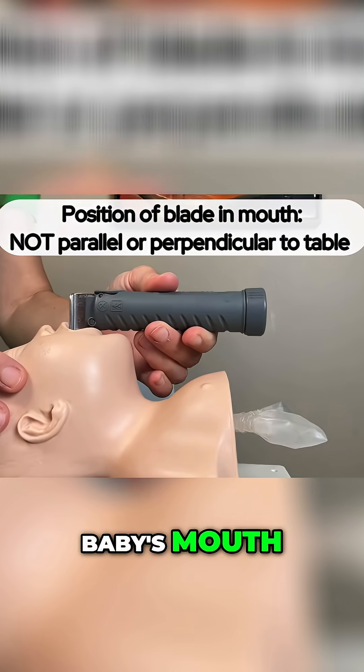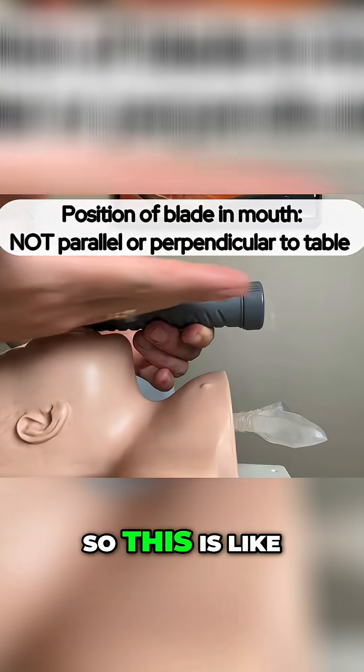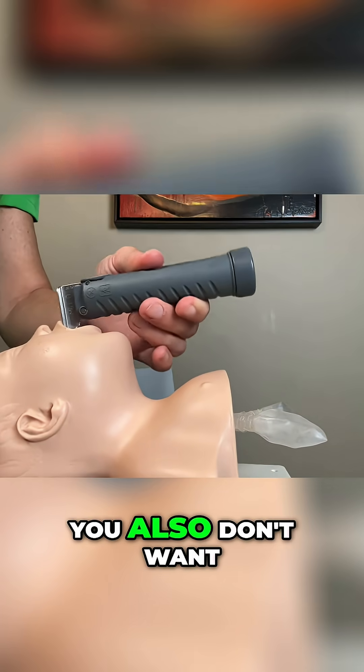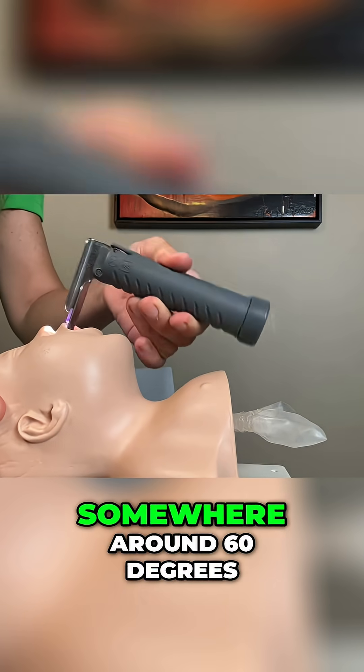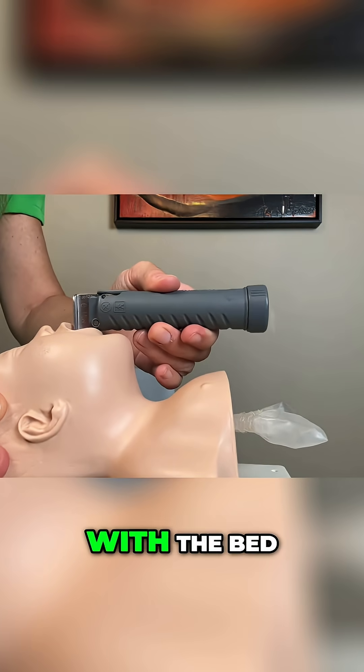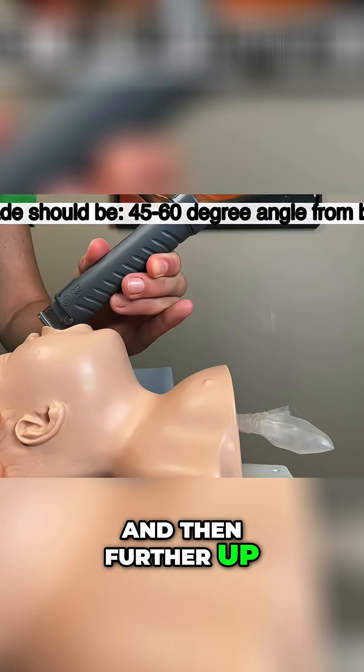you don't want the blade completely flat with the bed — that's zero degrees — and you also don't want it at 90 degrees. You want it somewhere around 60 degrees with the bed, so not at 30 but further up at 60. You're really at quite an angle from the bed.